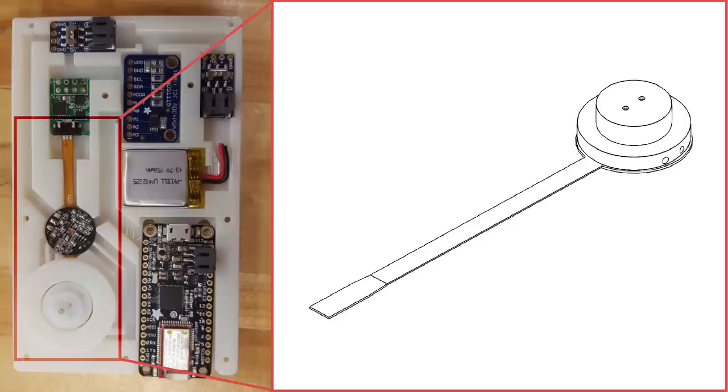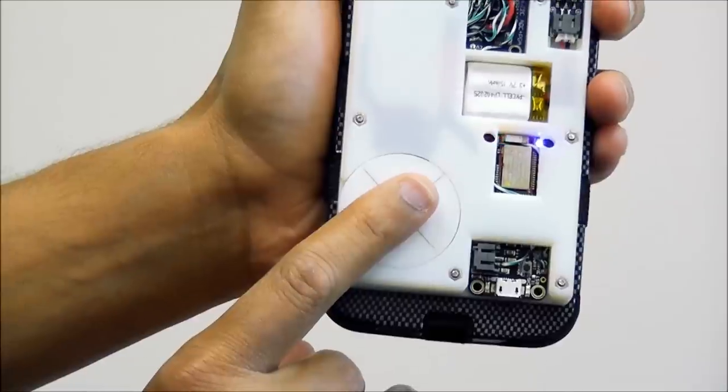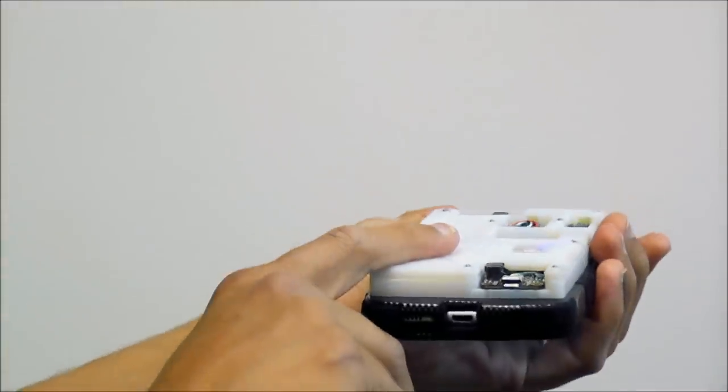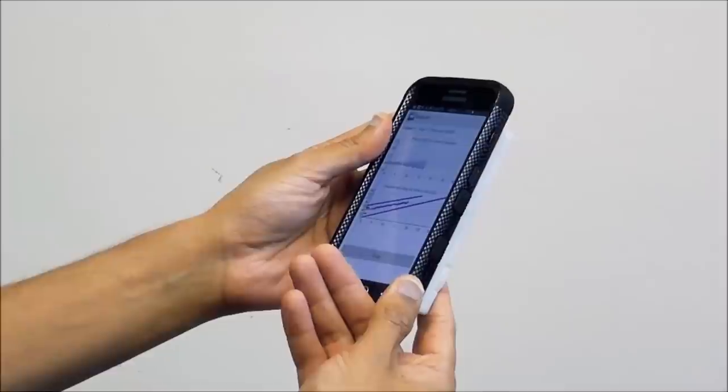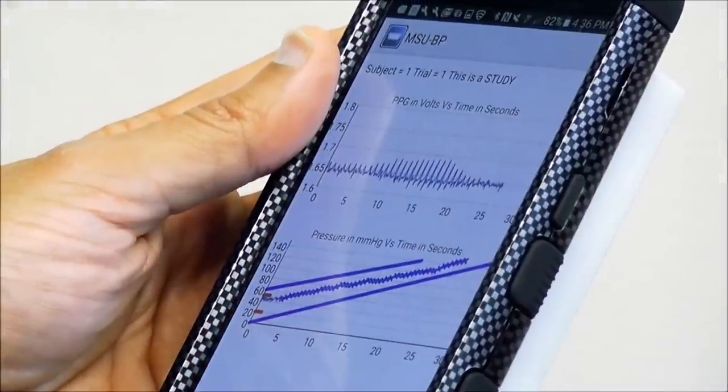The device is embedded with two sensors that measure blood volume and applied pressure in the finger artery. The case transmits the data via Bluetooth to an app on the smartphone, which computes the blood pressure and provides a visual display to guide the user and show results.